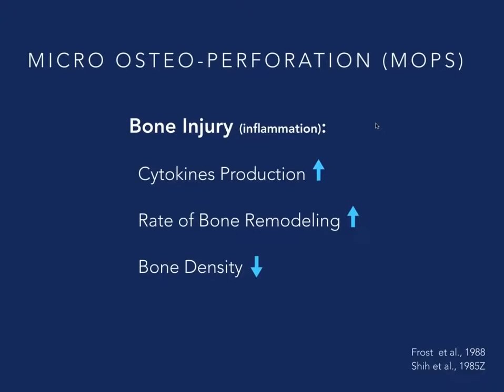Basically stimulating injury to a site around a fracture, and as you could probably guess, what drives a lot of decisions would be high dollar athletes. You have an athlete that breaks a bone and has a $2, $3, $4 million contract and is unable to play. What kind of detriment might that be for their team? So there's a lot of motivation to get that player back on the field quickly and safely. And Propel, or the micro-osseous perforation technique, has been shown to be very effective in this.